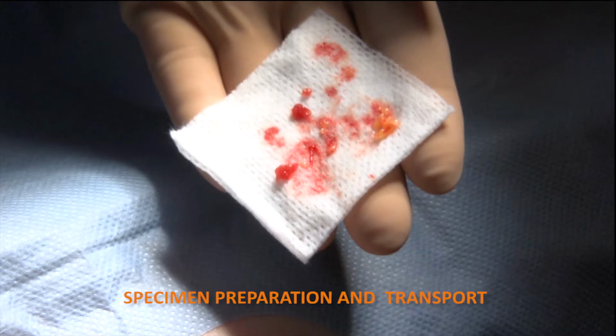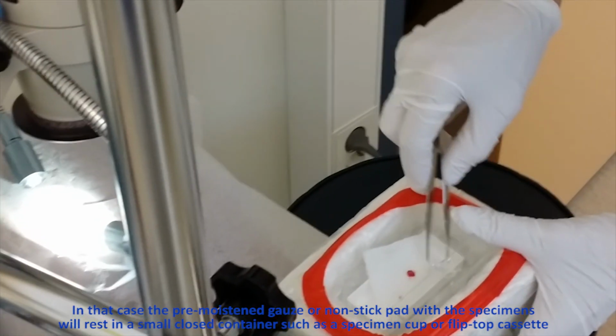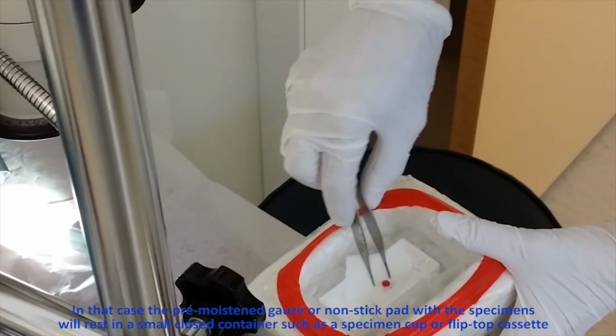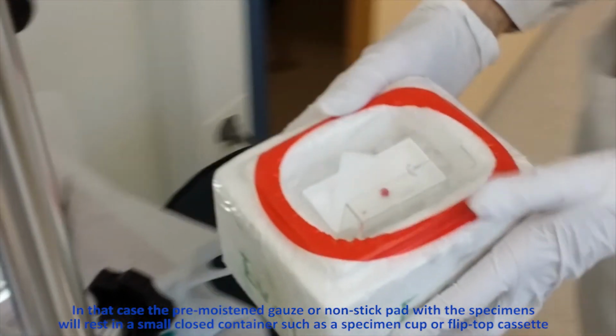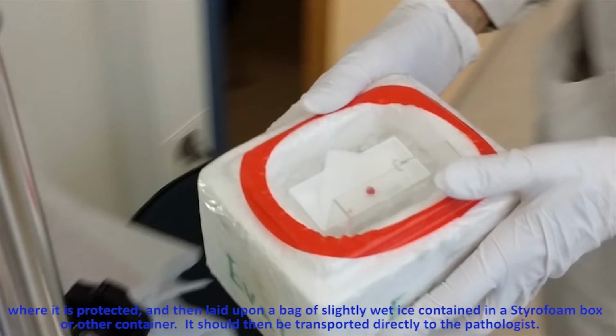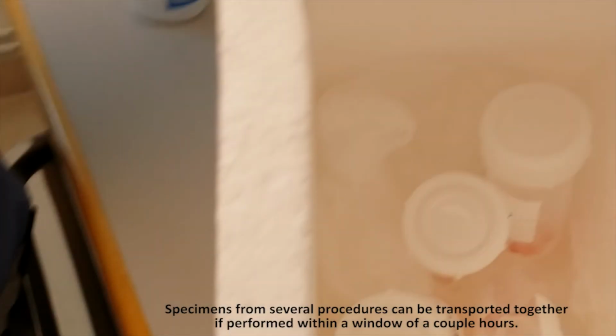Specimen preparation and transport. At the Karolinska, the specimen is prepped for the pathologist at the bedside. However, this may not be feasible at most institutions. In that case, the pre-moistened gauze or non-stick pad with the specimens will rest in a small closed container such as a specimen cup or a flip-top cassette where it is protected, and then laid upon a bag of slightly wet ice contained in a styrofoam box or other container. It should then be transported directly to the pathologist. Specimens from several procedures can be transported together if performed within a window of a couple hours.